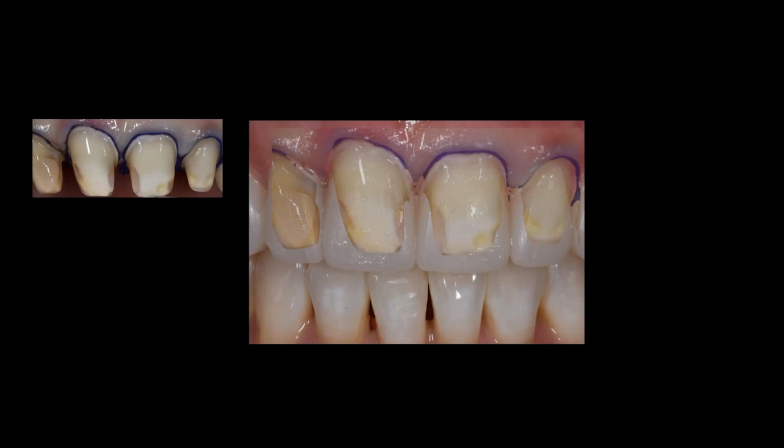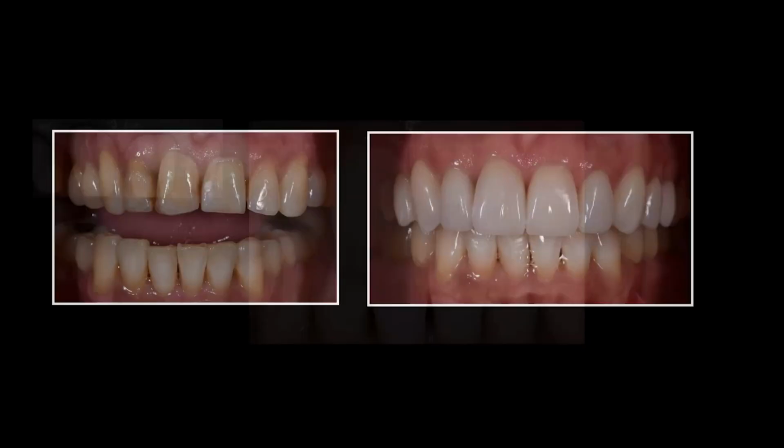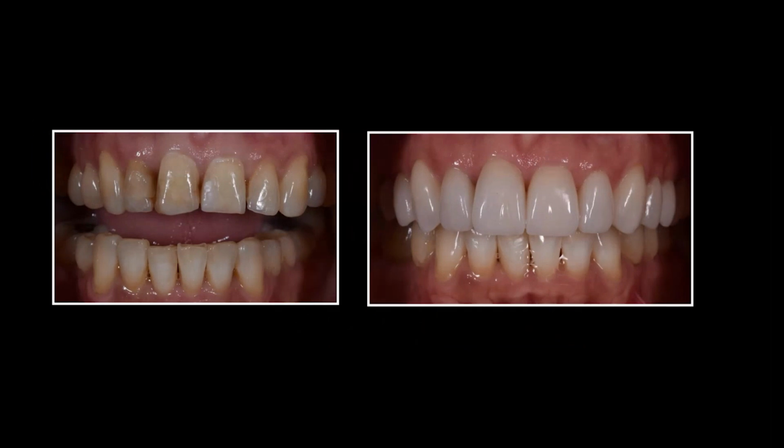She's still a young woman, and I think let's try to save as much of the tooth structure. So I'm going to try to manage that in the restorative part of that. We did wind up treating this with a lithium disilicate, and I'm kind of happy with this case in the sense that I struggle with some of the lithium disilicates in the sense that optically around the marginal area, they still tend to create some shadowing.